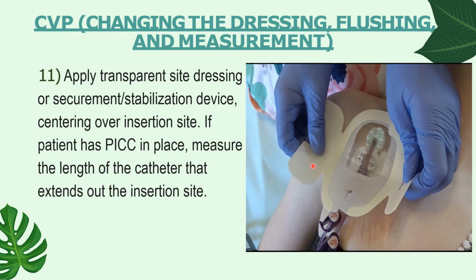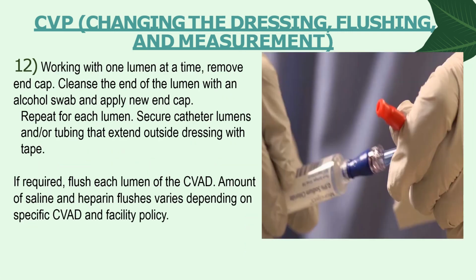Apply transparent dressing or securement stabilization device centering over the insertion site. If the patient has PICC in place, measure the length of the catheter that extends out the insertion site. It is important to measure how long you need.